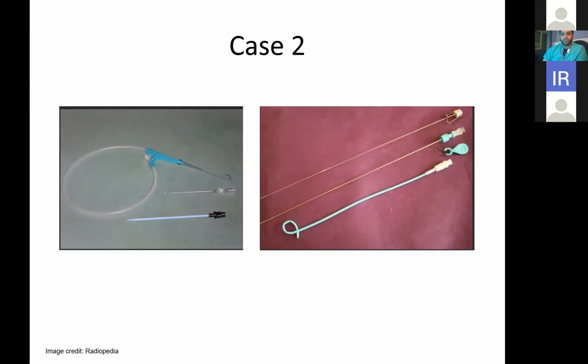And in terms of an ultrasound guided drain, that would require a few additional steps versus a biopsy that we would do. For example, you may place a needle with guide wire and things like that before putting in the actual pigtail drain. And of course, you can check the actual positioning of the needle with ultrasound, which is certainly a major benefit with regards to imaging modality of choice.